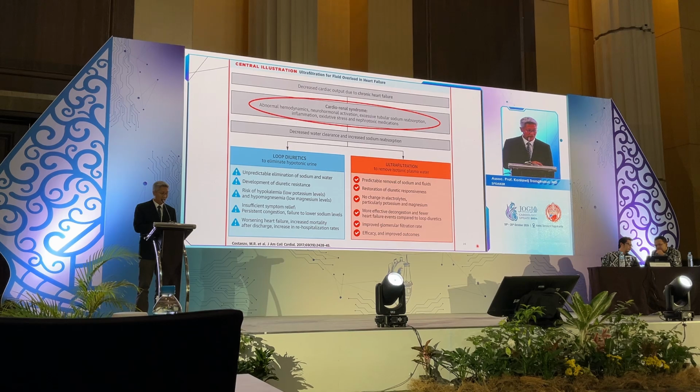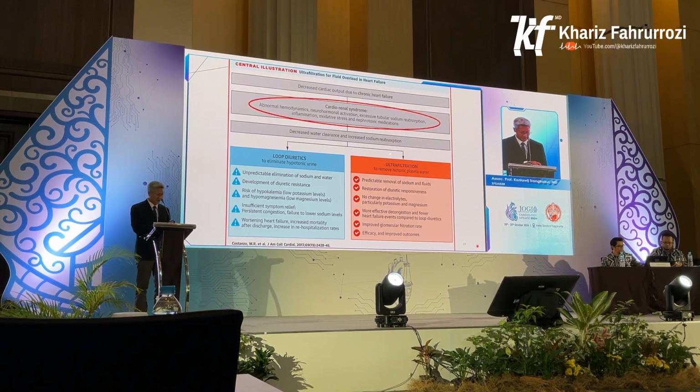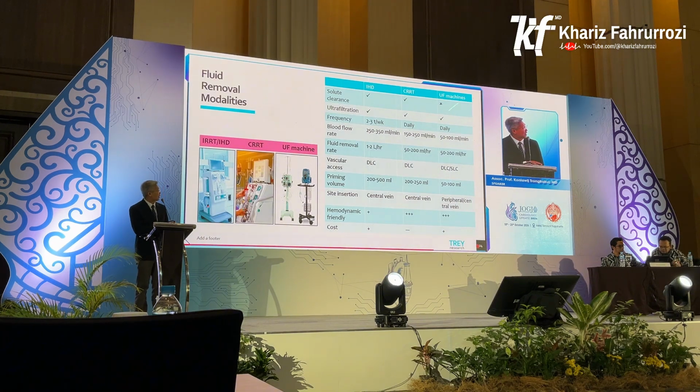I think cardiorenal syndrome seems to be one of your most common problems as well, because we have both diuretic and ultrafiltration. We discussed ultrafiltration a little bit, but you can see that diuretic is also a treatment, but it can cause the patient problems as well, especially electrolyte imbalance or even renal dysfunction. Ultrafiltration is another option to remove just fluid, but solute cannot be removed by this technique.